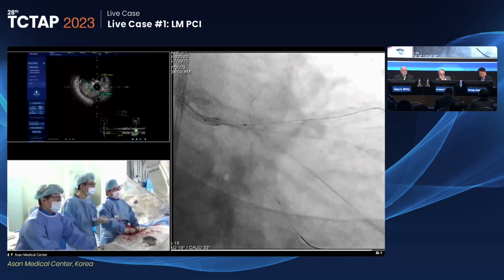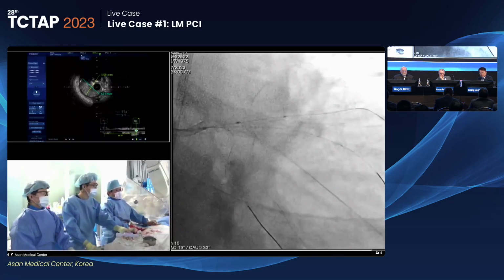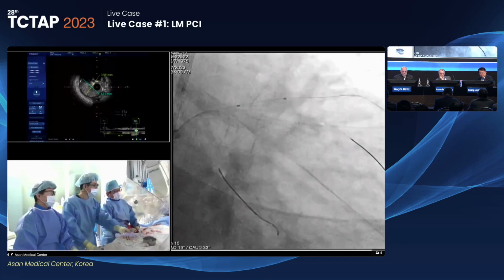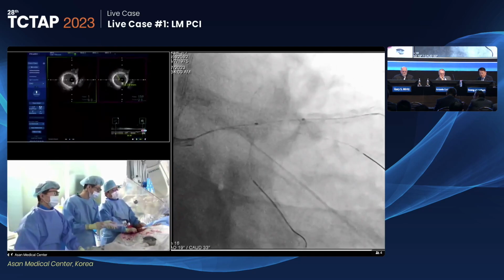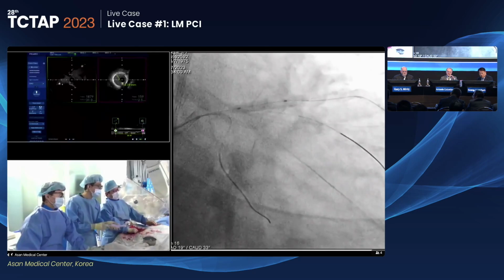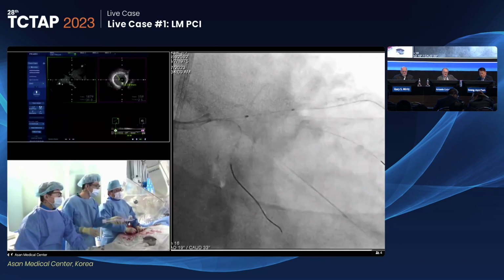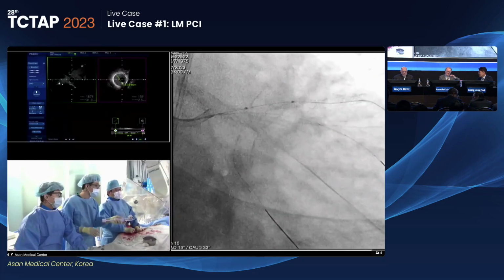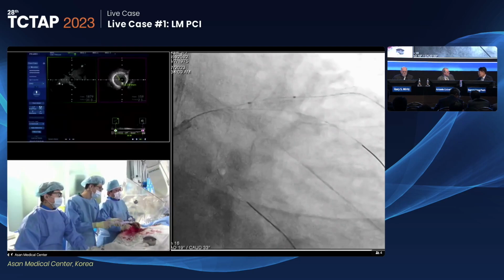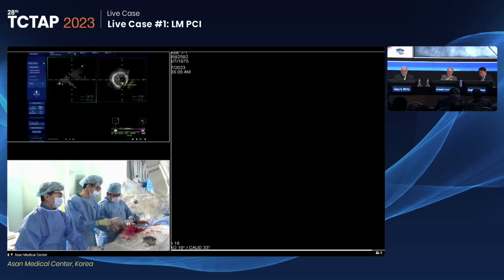So could you give me the stent? Do we need to do a little bit of lesion preparation for the LAD? You know, that focal spot of concentric calcifications. What size balloon is this? This is a 4.0 millimeter balloon. Yeah, 4.0. But I think in a young man like this, you have to limit stenting. You cannot place 3 stents in a 48-year-old. Deflation, please.